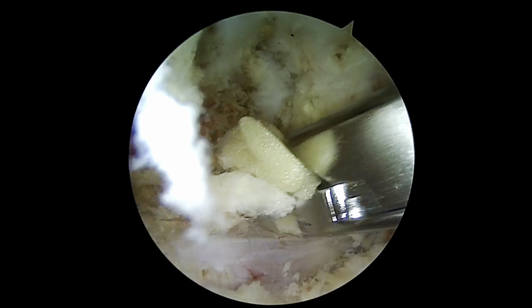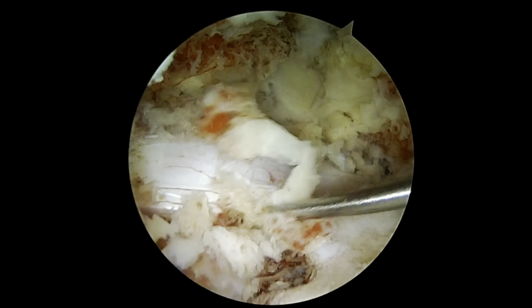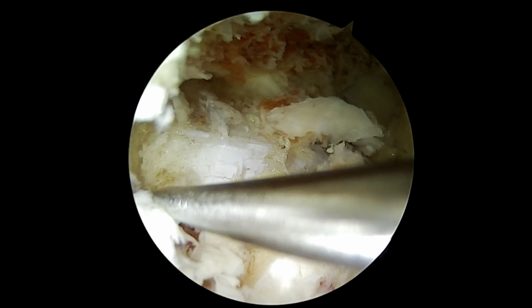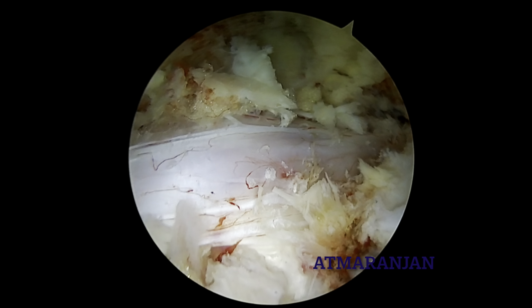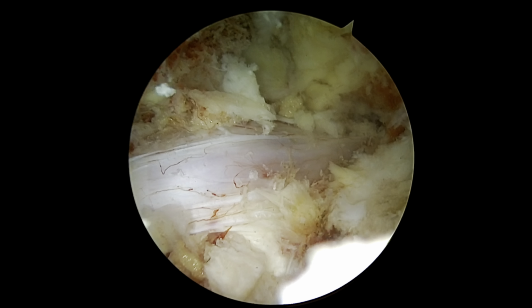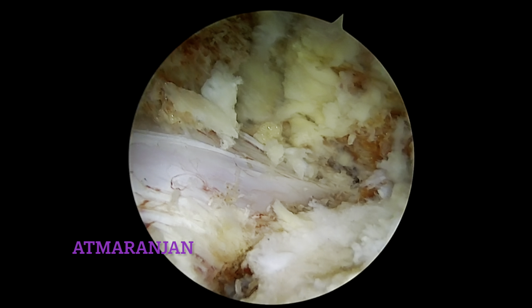So we are working now on the contralateral SAP, which is visible, and you can appreciate how thinned out the cord is because of severe canal stenosis. So this is the pedicular area and disc area of L4-5, and you can see I have well extended the decompression to L5-S1 also.